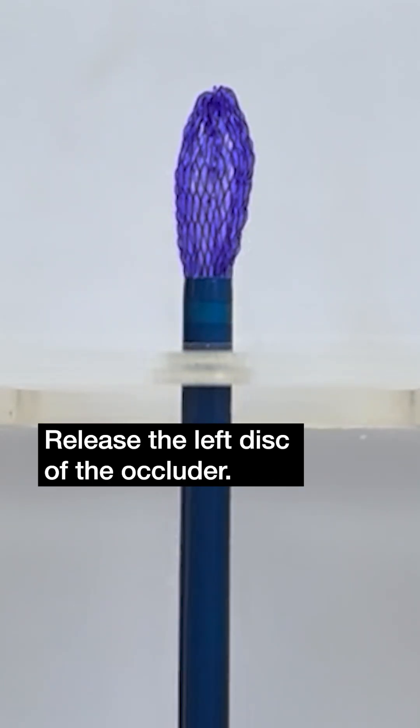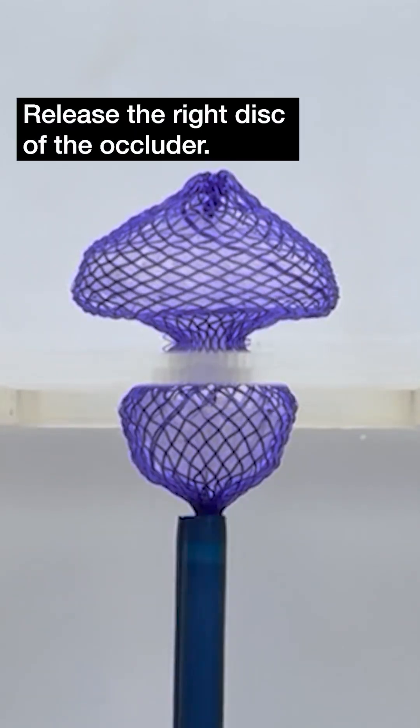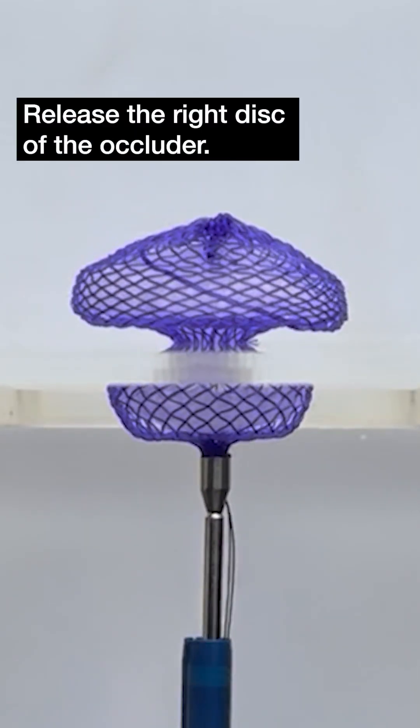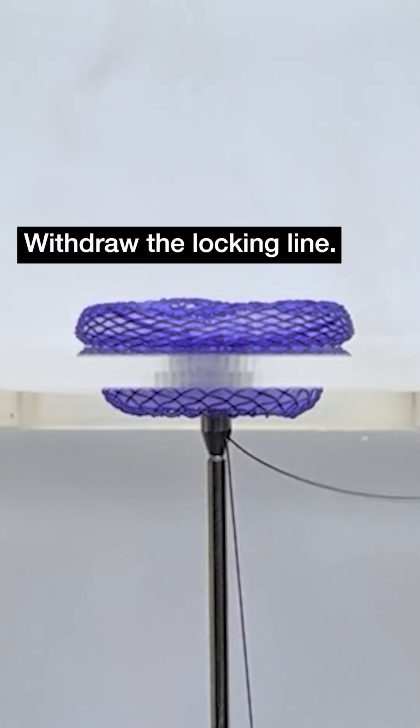Here is the simulation of the occluder implantation process in vitro. Release the left disc of the occluder. Release the right disc of the occluder. Lock the occluder. Withdraw the locking line.